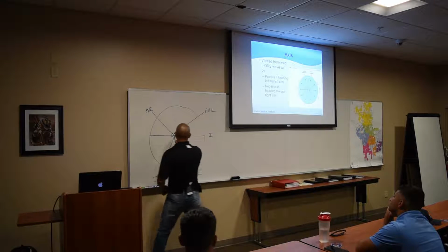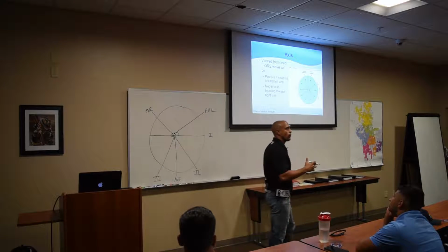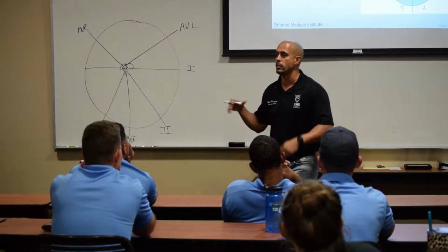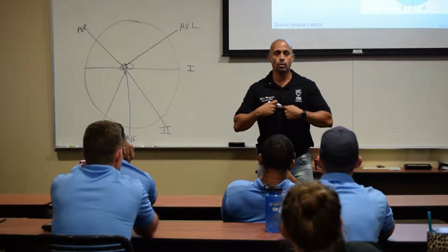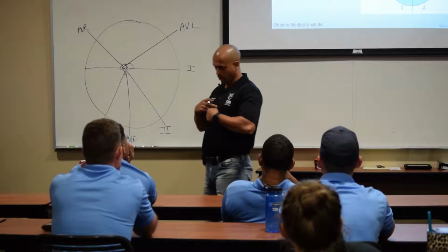That's it. Then right here, you have what's called the Wilson's central terminal. Have you ever heard of that before? The Wilson central terminal. That's how electrophysiology works. When you put the monitor on, it uses that Wilson central terminal. So that's at the center of the heart. And then the electricity moves towards that lead of the way it's vectoring in. So I start at the Wilson's terminal, and that's where I'm looking.